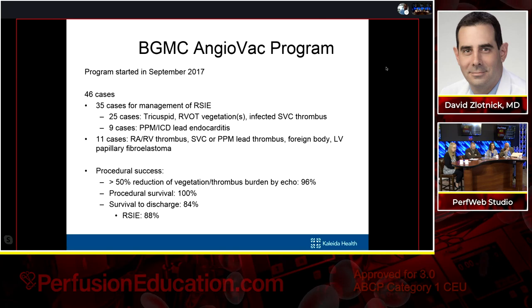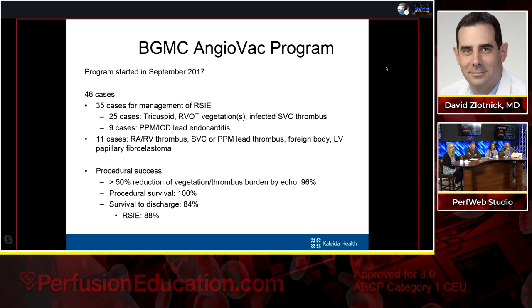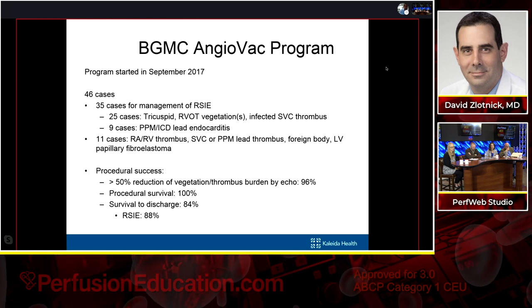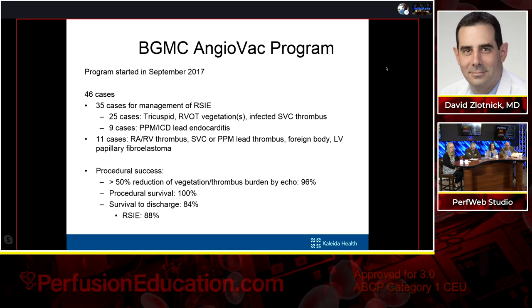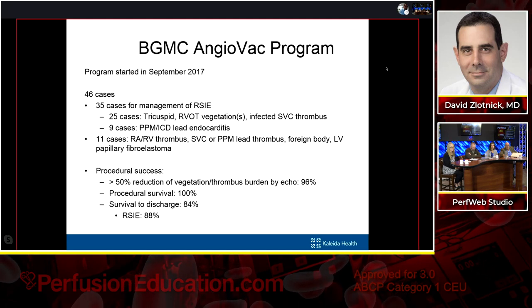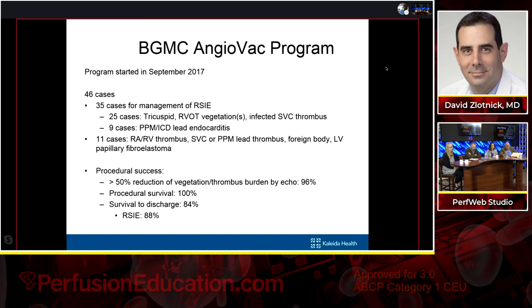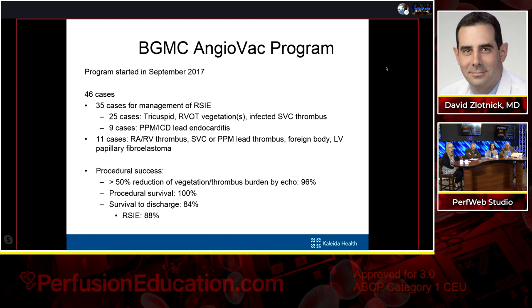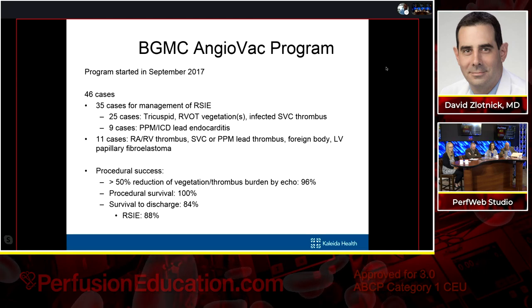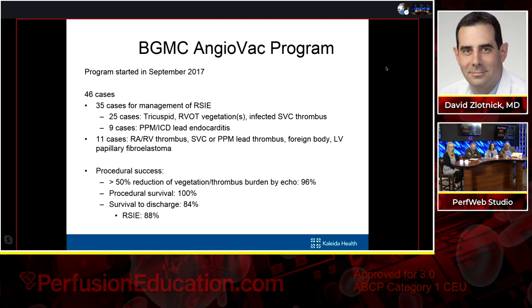And so we started our formal program in September of 2017, so we've just been a little bit over 2 years into our program. We've done 46 cases, 35 for the management of right-side infective endocarditis, 25 for tricuspid RVOT vegetations or infected SVC thrombus, 9 for pacemaker ICD lead endocarditis, and we've done 11 cases for RARV thrombus, SVC or pacemaker lead thrombus, 1 for foreign body, and 1 for an LV papillary fibroelastoma.